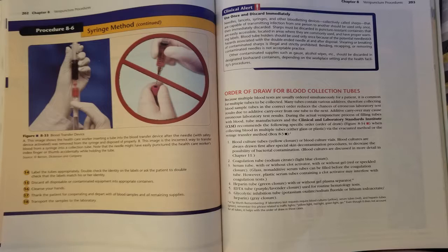Order of draw for blood collection tubes. Because multiple blood tests are usually ordered simultaneously for a patient, it is common for multiple tubes to be collected. Many tubes contain various additives. Therefore, collecting blood sample tubes in the correct order reduces the chance of erroneous laboratory test results due to additive carryover from one tube to the next. Additive carryover may cause erroneous laboratory test results.